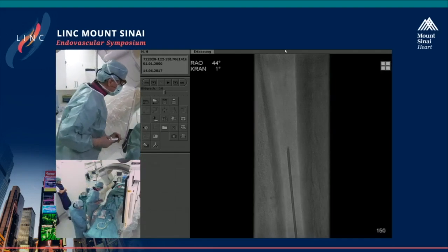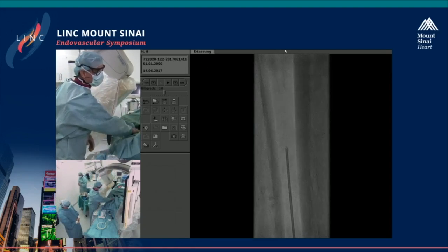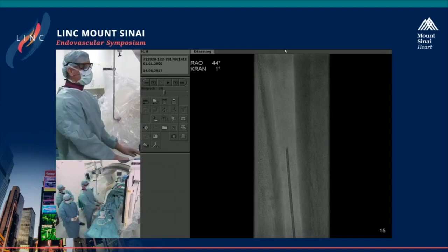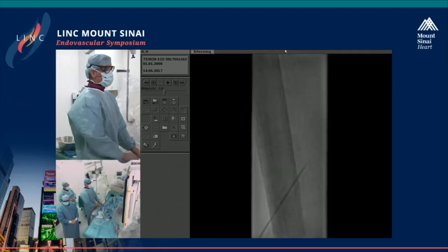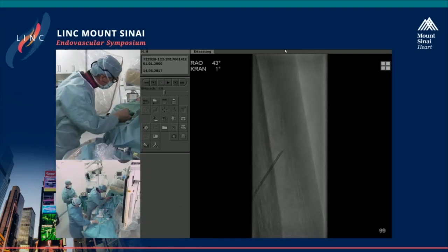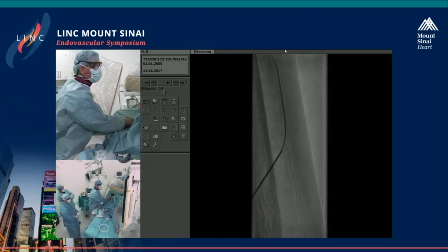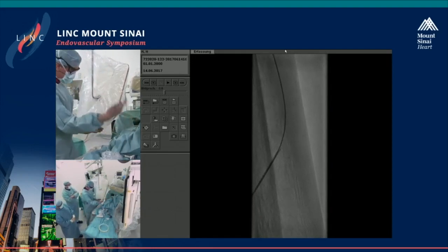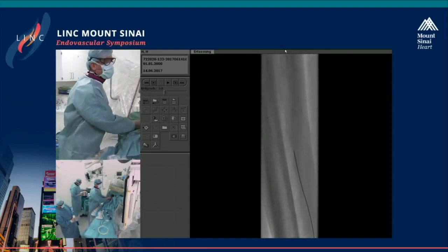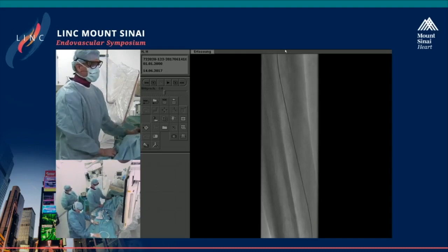Yeah. Okay, I didn't inject anymore, but I felt the calcium of the artery. And either you switch, I'm not sure whether you can see the blood coming out of the needle, probably not. Either you switch to another oblique view here to see, first of all, where the needle tip actually opens to. I think this is also important, that the needle tip opens to the head, so to say. And then in this other angulation, in a controlled way, you take here the wire in. And this is, for this access, usually an 018 wire.